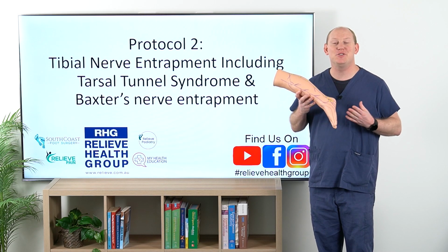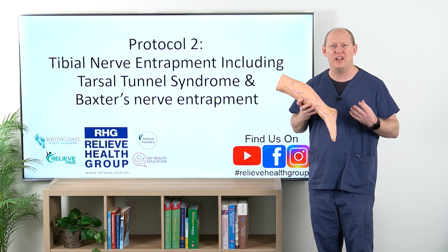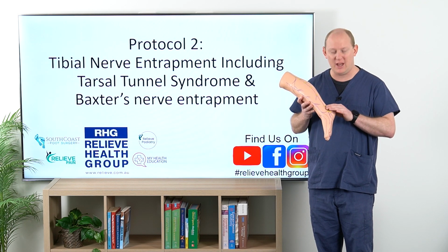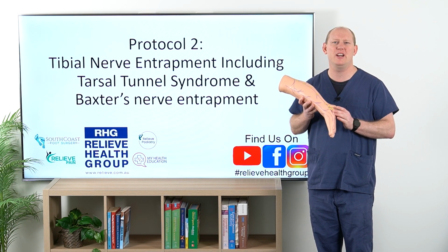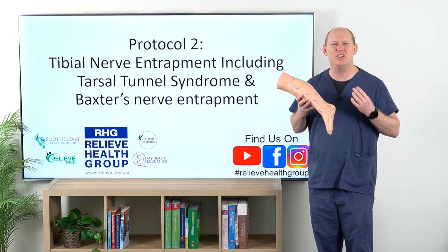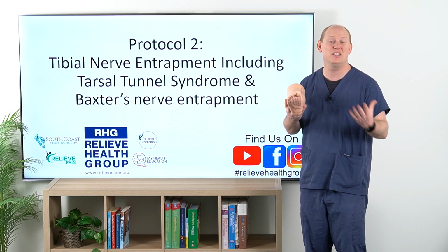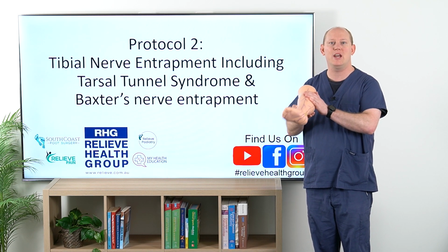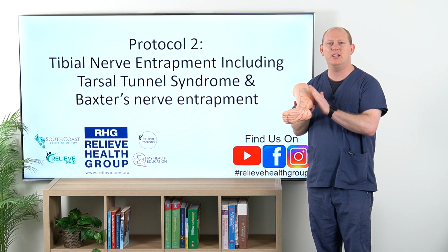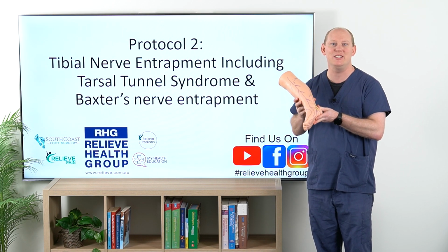Hey everybody, let's talk a little bit more about tibial nerve entrapment. That's going to include our tarsal tunnel syndrome, but also let's not forget our Baxter's nerve entrapments as well. Initially, for positioning of the patient, I'll typically have them sitting in my chair, and I'll rotate the leg out a little bit, just so that I can get a better feel and look at where I'll be treating.